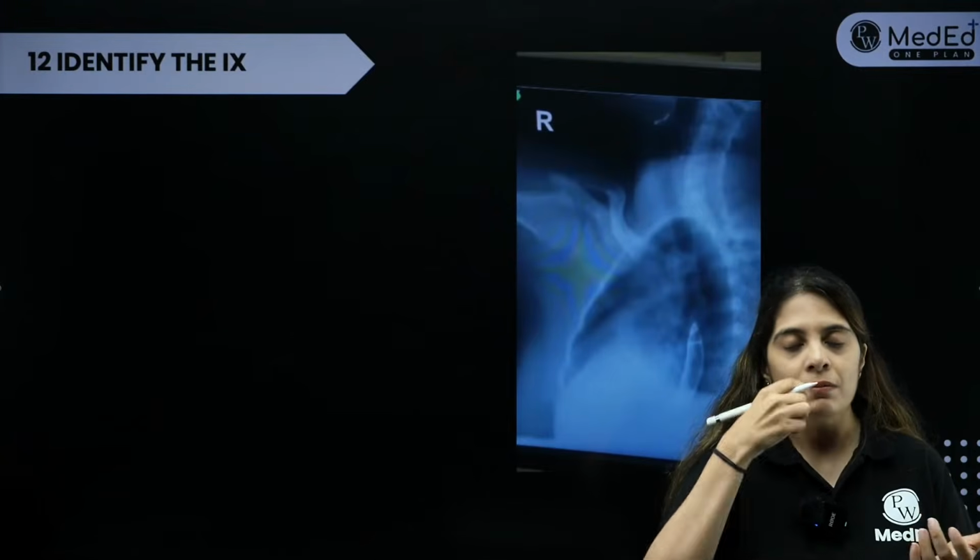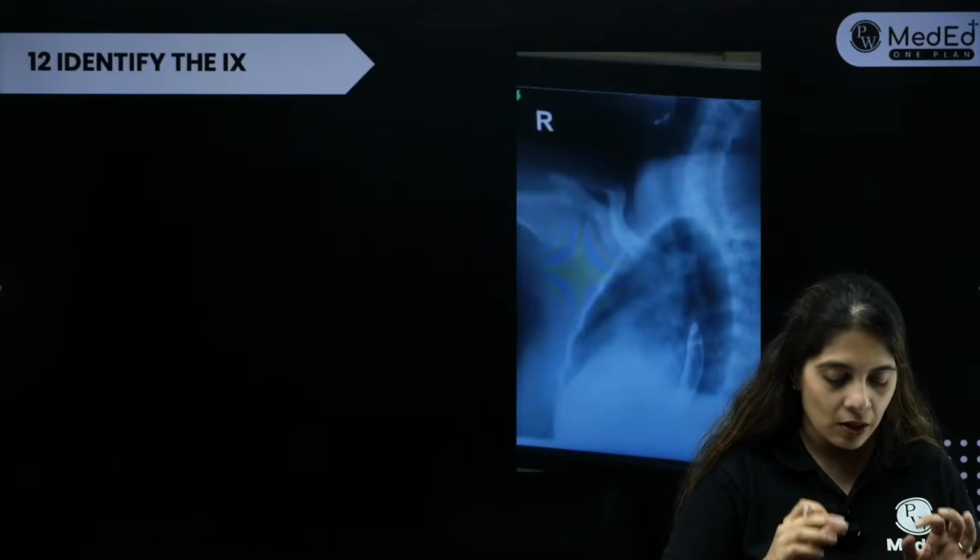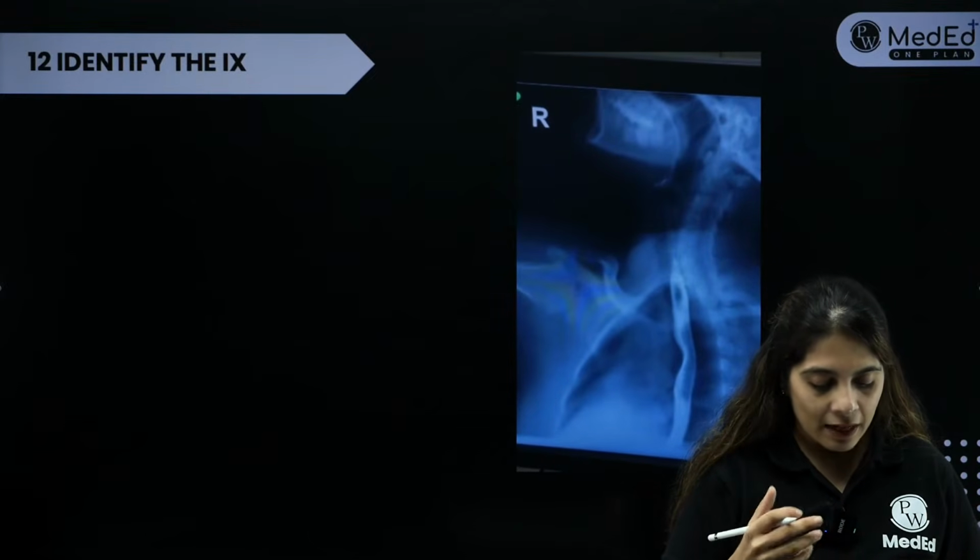Okay, the patient along with barium has also taken some air, so that is what is being seen. So this is an absolutely normal barium swallow. Now why have I included this?